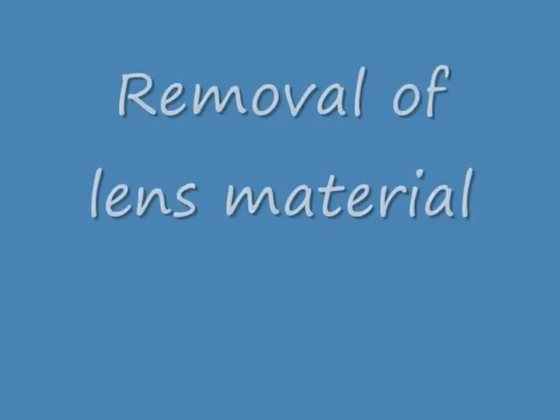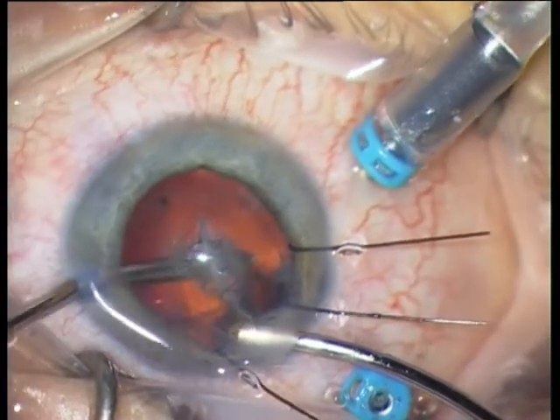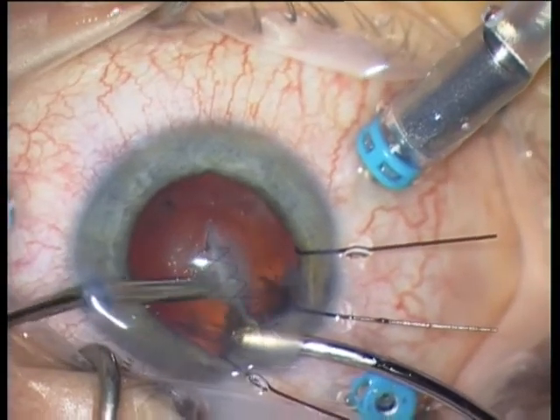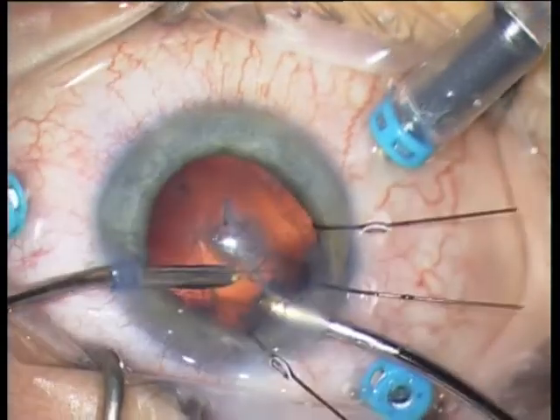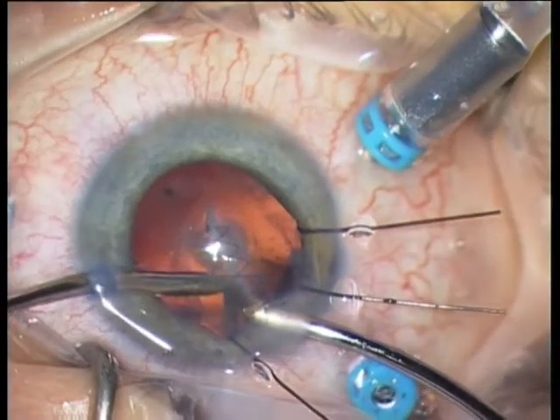It looks pretty quiet. I am removing here cortex material from the lens, and also with irrigation and aspiration from the limbus. It is very important to preserve the anterior capsule in order to be able to perform a sulcus implantation of the IOL.